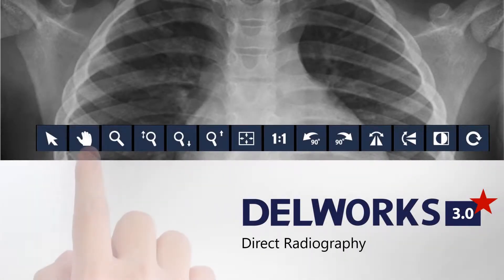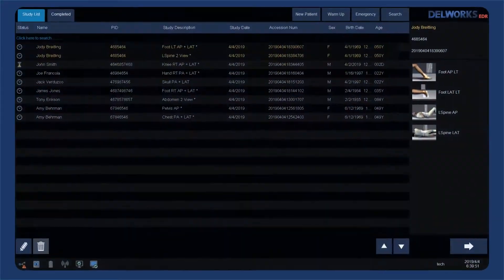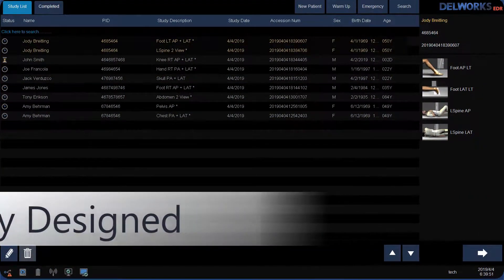This is DellWorks 3.0 Digital Imaging by Dell Medical. The DellWorks user interface was intuitively designed for enhanced workflow and efficiency.